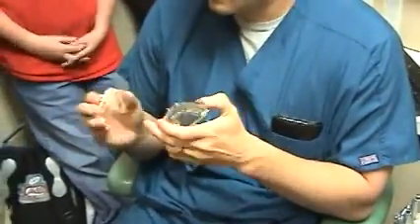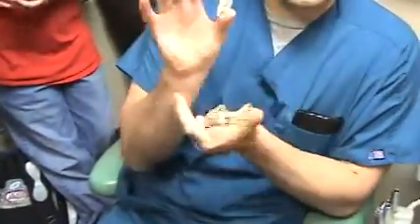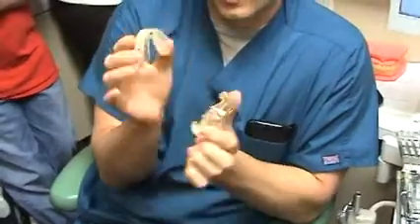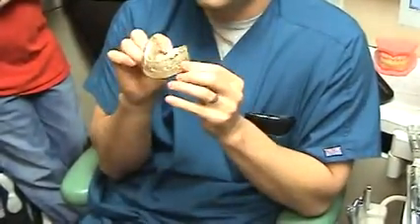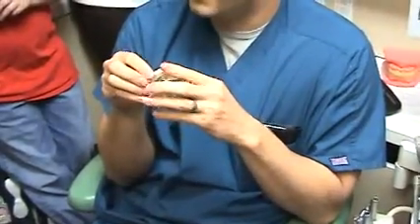Probably hurts? Well, it's not bad. The denture has housings in it, which help to retain and keep that lower denture down. It kind of snaps down in. Okay? I'll go ahead and pass that around. You guys can have a look at that.